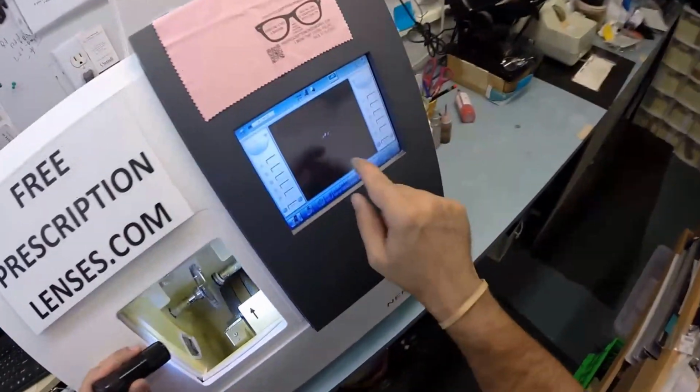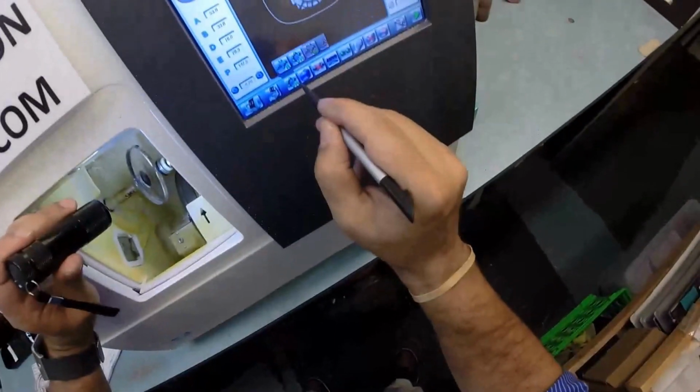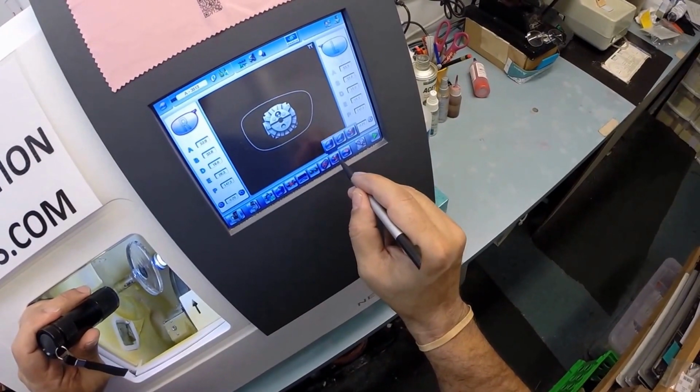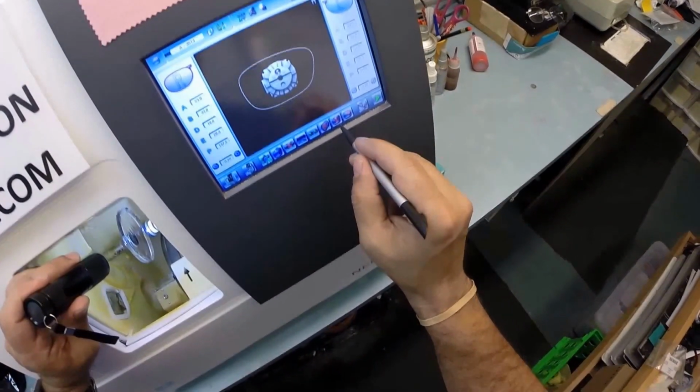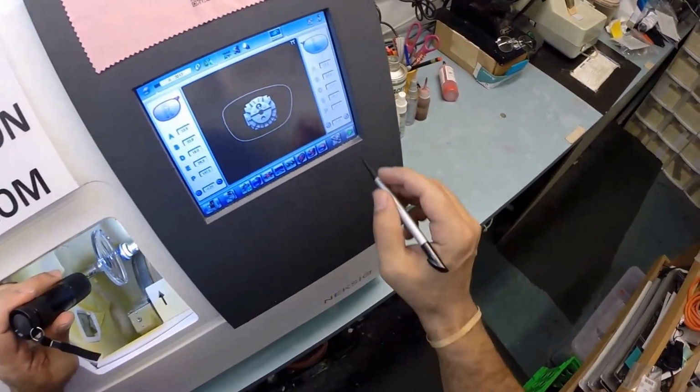But I'm going to wake up the computer. That is the shape of your lens. These are, let me use my stylus, these are polycarbonate lenses. I do not want to polish the edges. I do not want to put a bevel on the front surface of the lens, the convex surface. I only want to put a bevel on the rear concave surface of the lens.